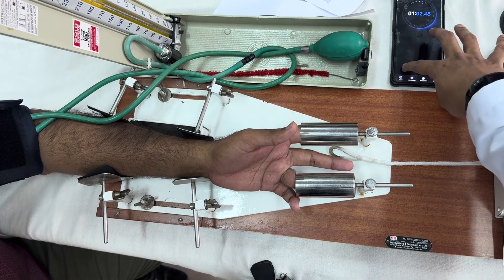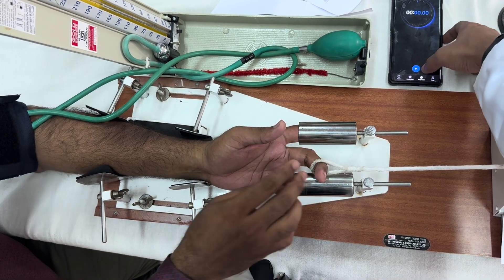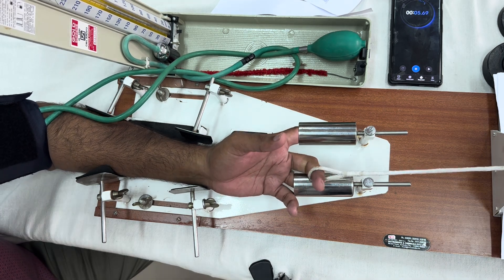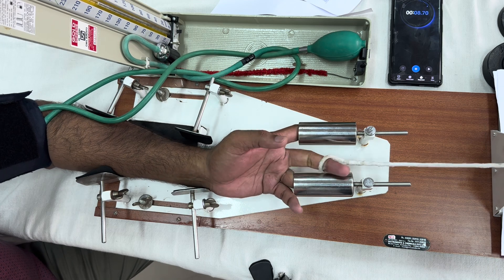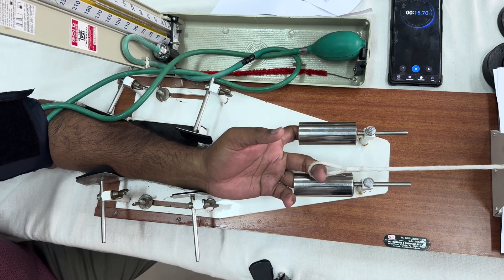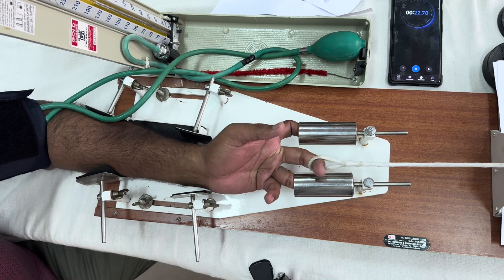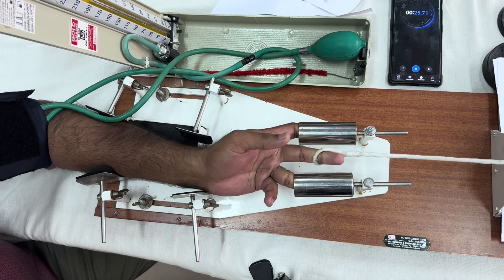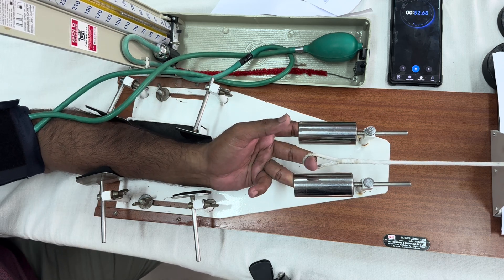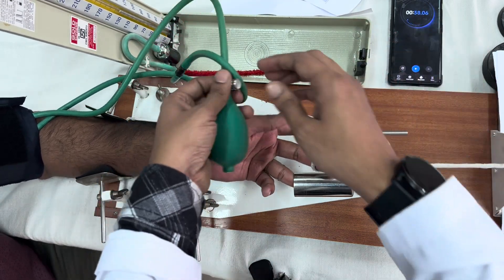Once the pressure is raised, give the same instructions and start the procedure immediately. Start. The person is performing the contractions and we are getting the recordings. Let us observe the total duration and the effect of fatigue. Every one second the person is contracting. We will see the total duration and the work done ultimately. Earlier we got 44 seconds with venous occlusion, so here the duration will be even less. It is already 30 seconds — 32, 33 seconds. The person is no longer able to do it. We stop at 36 seconds.